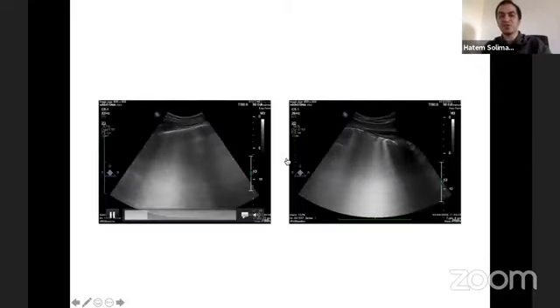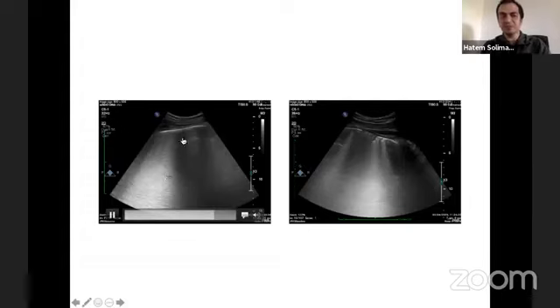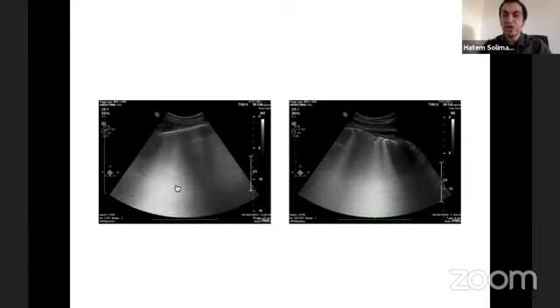And when you scan the patient with the curvilinear probe, this is very typical. It is typical for ARDS, but we see it very commonly in patients with COVID-19. This curtain-like patchy alveolar edema. So the B lines are vertical comet tails, which reflect an increase in the extravascular lung water. So the presence of fluid in the interstitium or alveoli can cause these vertical comet tails. And here you don't often see isolated B lines because they are plenty, they are a lot, and they are combined together in a confluent way to make this shiny white curtain.